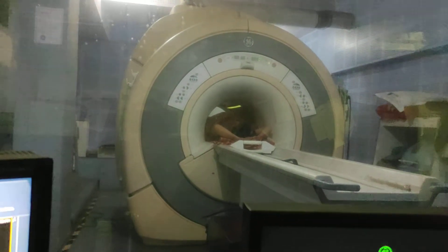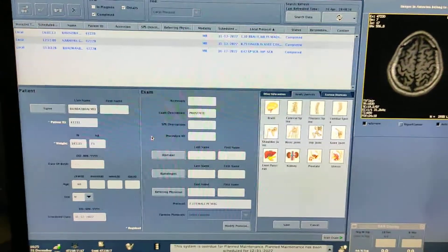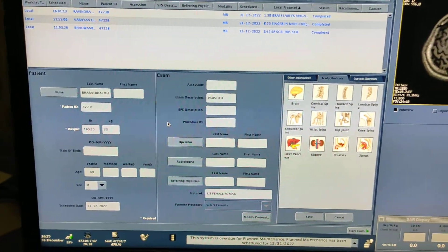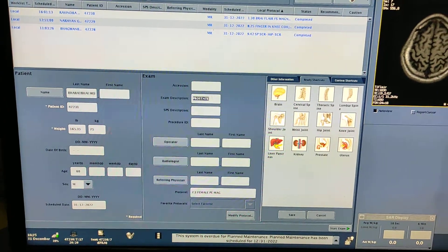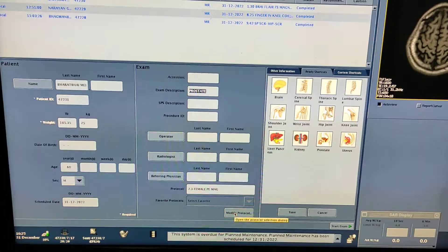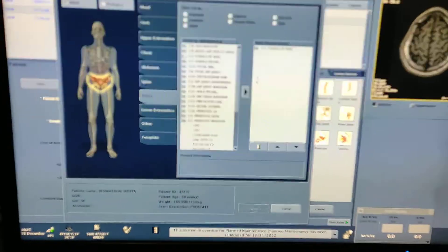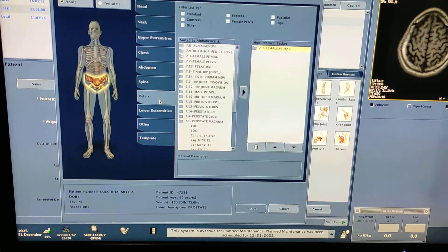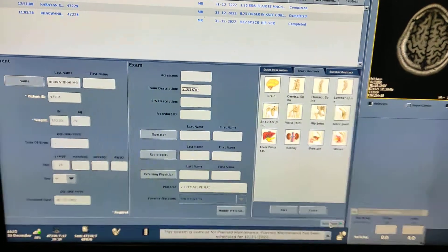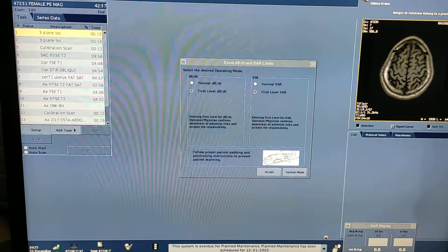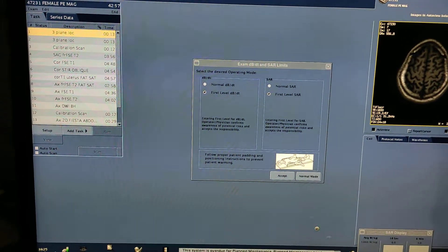You can set the body array coil to two-three or three-four, whatever you like. Patient position is feet first; scan is done in body array coil. Now we are at the entry desk. First, you have to fill in the patient data description, then select the protocol. I have kept my protocol in pelvis. Select start exam.